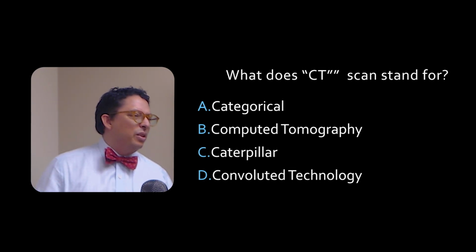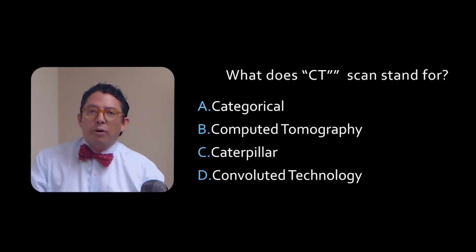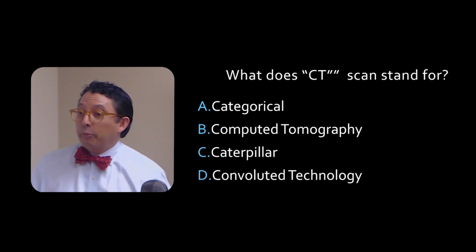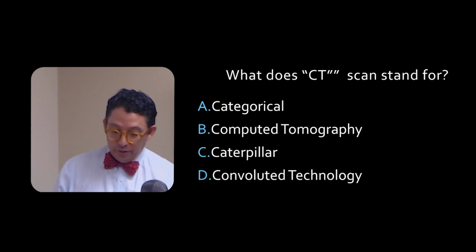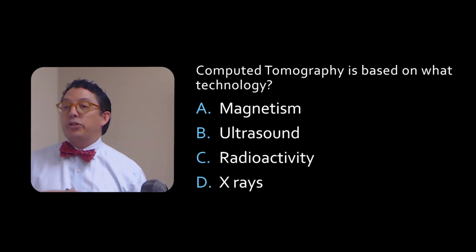So what does CT stand for? Is it categorical? Is it computed tomography? Is it Caterpillar? Or is it convoluted technology? No, it's not Caterpillar. I know you wanted it to be, but it actually stands for computed tomography. Now, computed tomography is based on what technology? I just told you this.